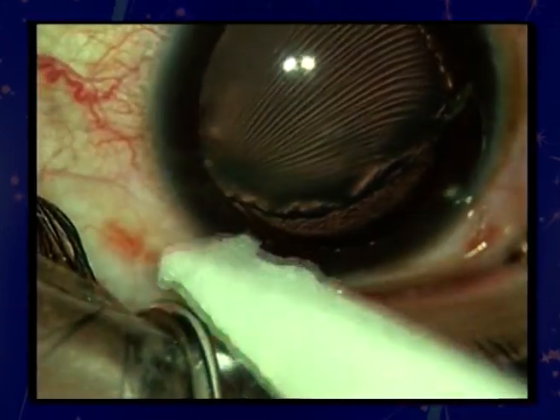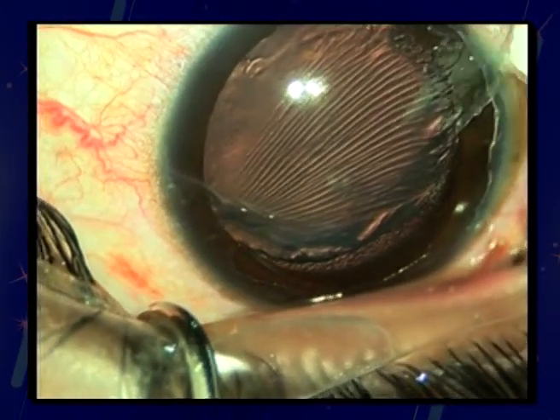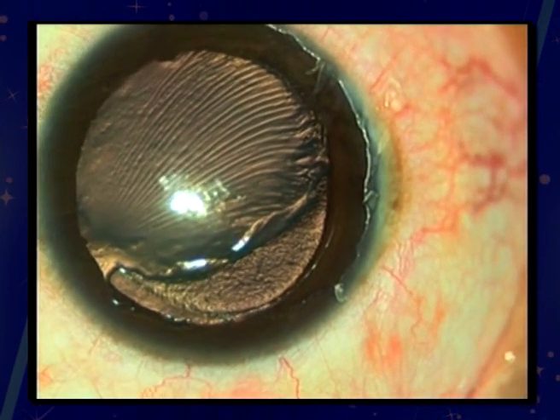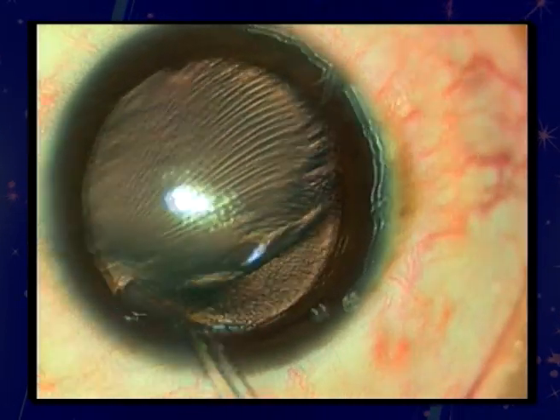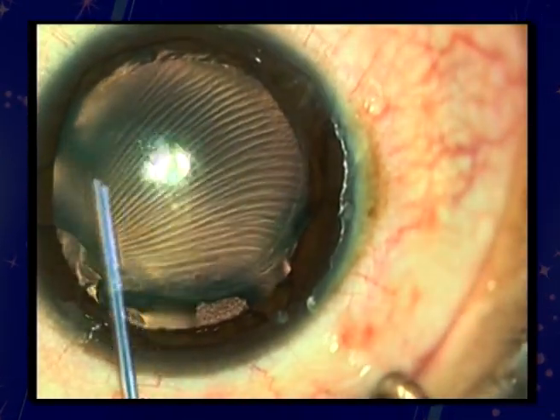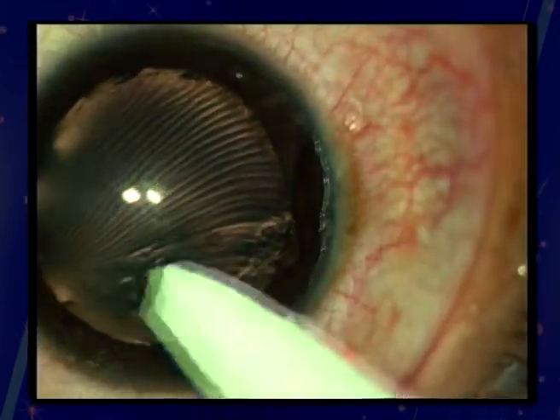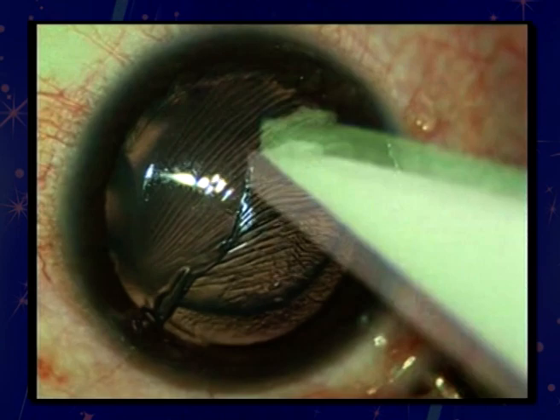The third case shows a similar situation with a flap slippage with dense flap folds and epithelial ingrowth. A merosal sponge is used to completely remove all epithelium on the exposed stromal surface and a 2 mm margin around the flap. The flap is floated into position. The epithelium on the surface is also removed to facilitate the removal of striae.